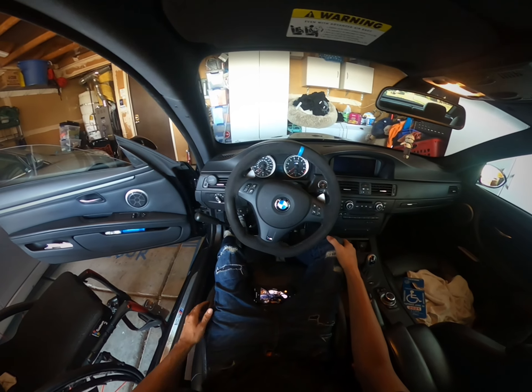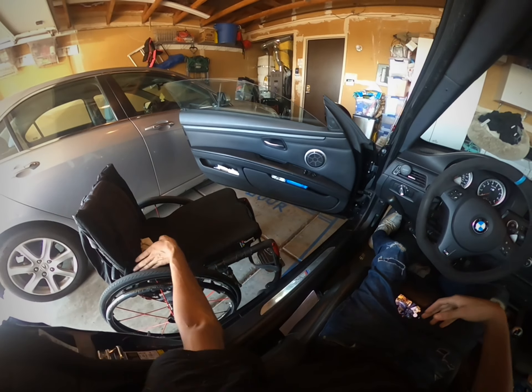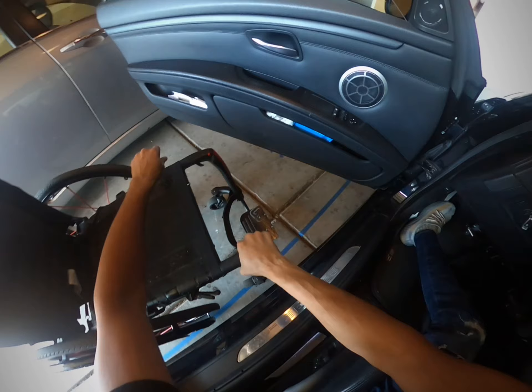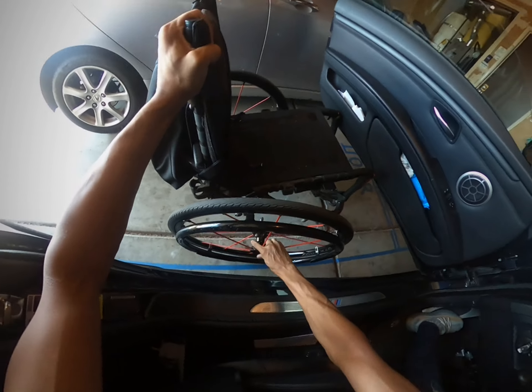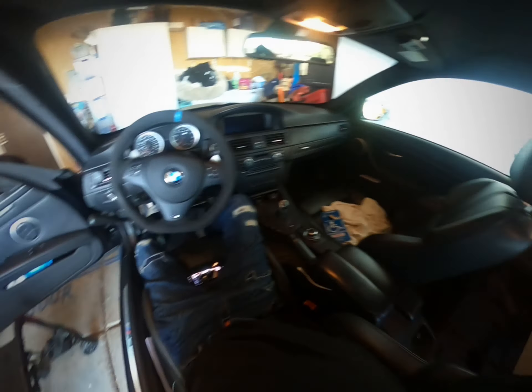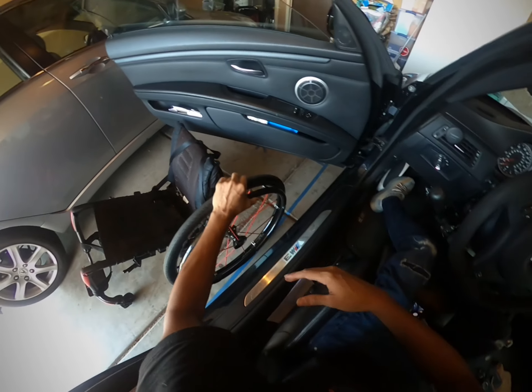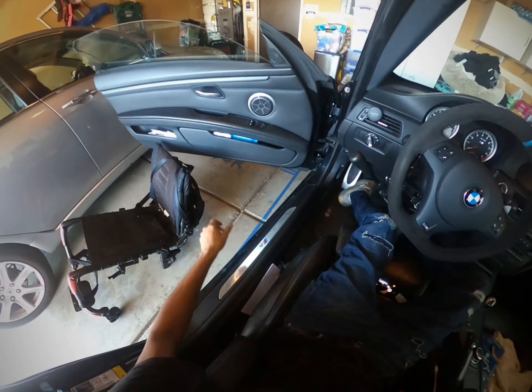I always make sure my foot is on the kick plate. I take my chair out by taking the seat off, putting that right behind me, and I undo this here. Then I take each wheel and set them behind me. This wheelchair is actually very light — it's about seven pounds and it's made of carbon fiber.